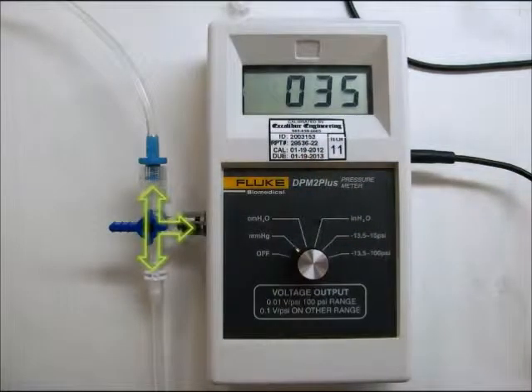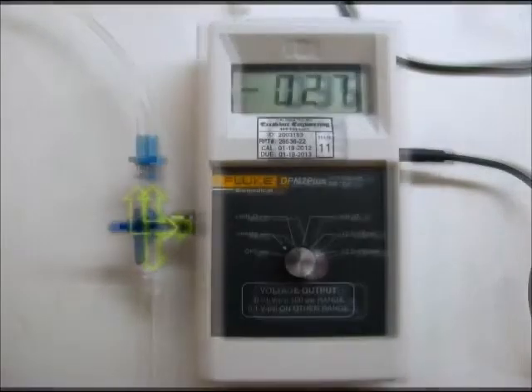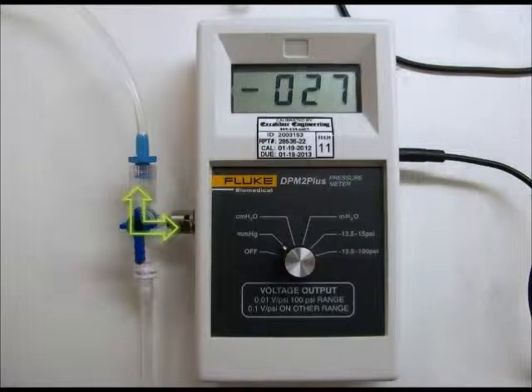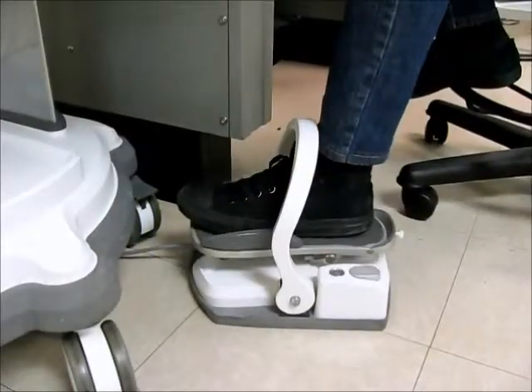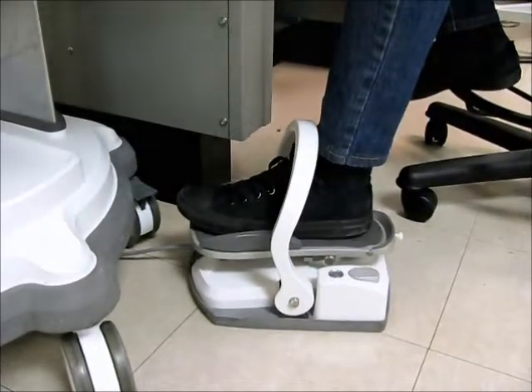When the T-valve is open, fluid is free to flow through the system. To simulate the occlusion, we close the T-valve to the irrigation line. Vacuum builds up in the aspiration line, which is detected by our pressure sensor. Opening the T-valve acts as a post-occlusion surge. Vacuum is released from the aspiration line, and the sensor detects variation in flow due to the expansion and contraction of the tubing. The vacuum is applied by pressing the foot pedal attached to the WhiteStar system.